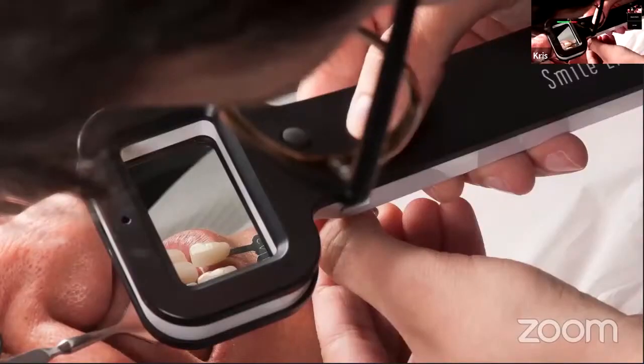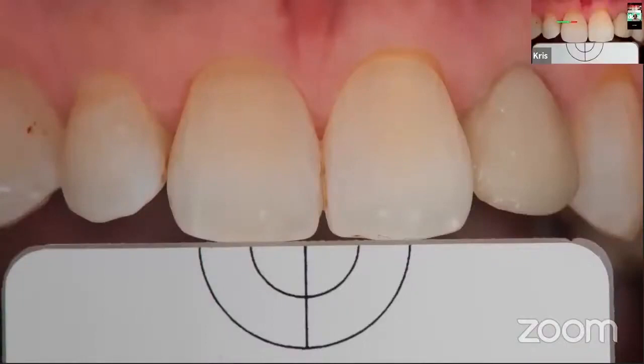You can also use a tool for reading or checking the color, especially dental technicians, they like it if they have such a possibility. They come with the shade guide. And in our clinic, we have this type of tools which emit light of 5,500 kelvins. It gives us this white light just for safe reading with, let's say, natural or objective light. For color measurements in our clinic, we work with the digital workflow.